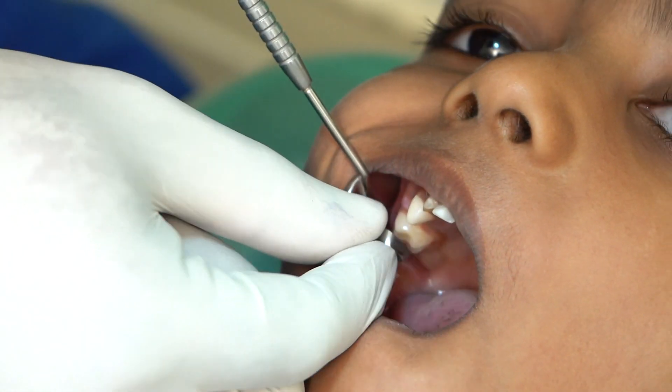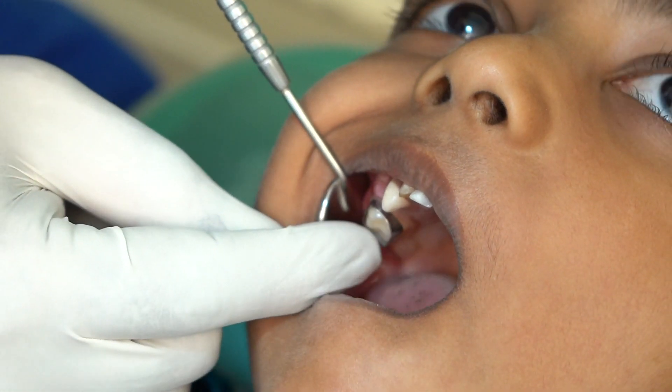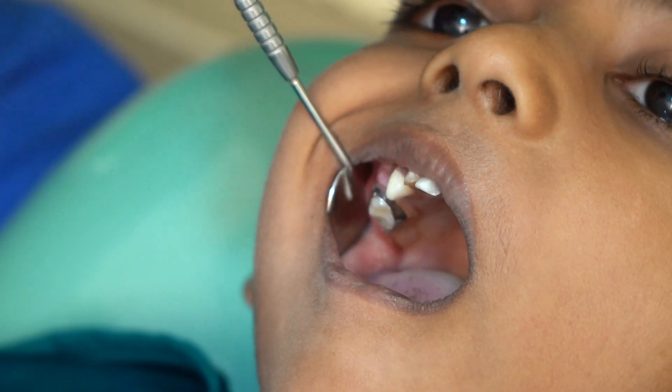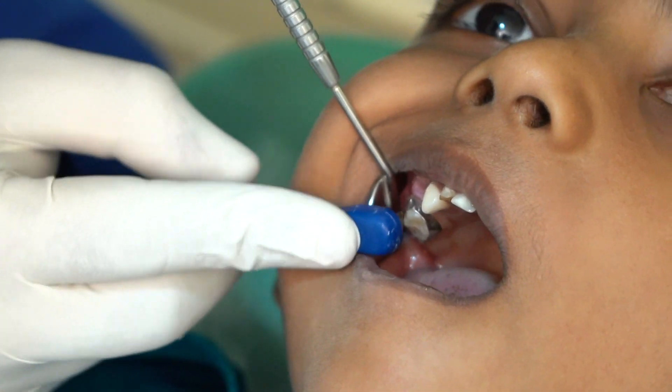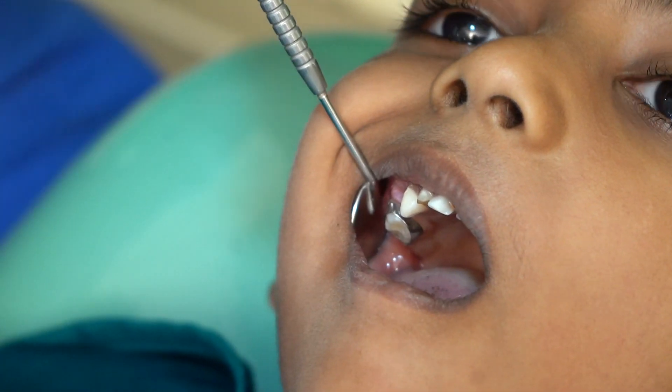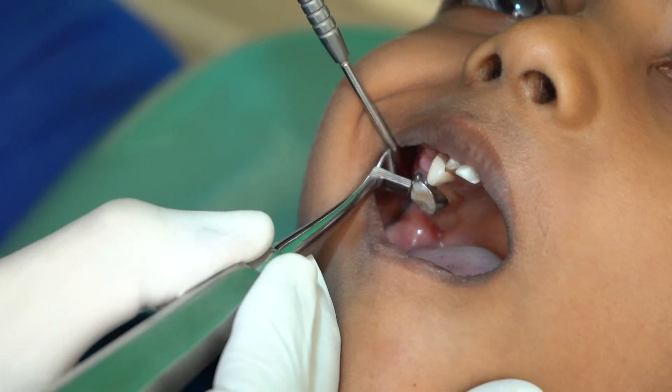The band is initially placed by hand pressure on the mesial and distal surfaces, bringing it down close to the height of the marginal ridge. Then, using the band seater, pressure is applied on the mesial and distal buckle corners. The band is then adapted to the tooth using the band pusher.